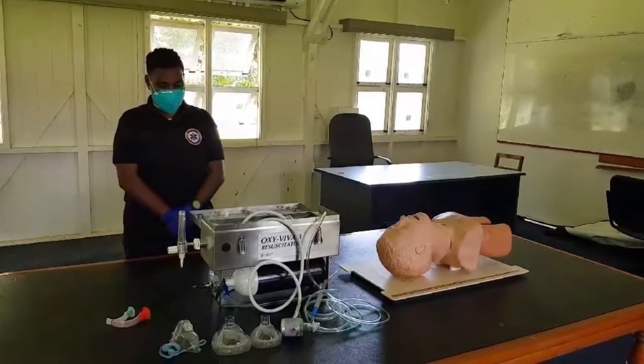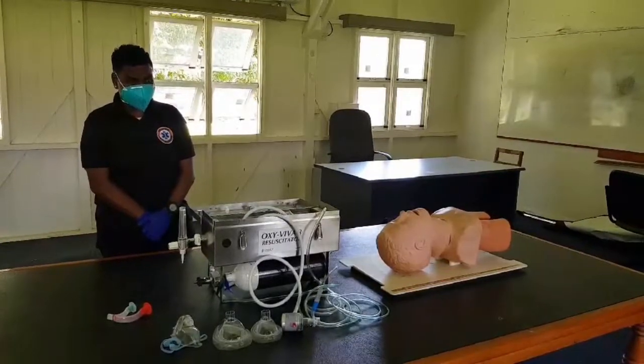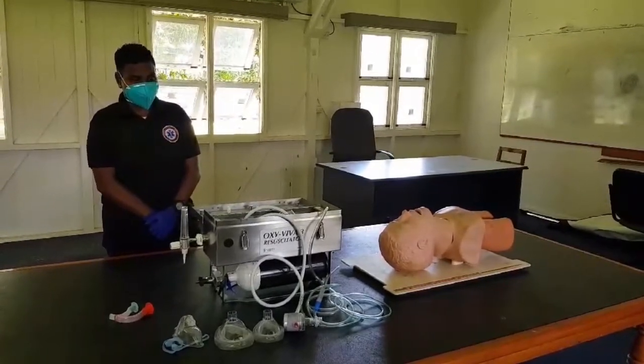One of our volunteers at FACT will be demonstrating how to use the Oxy-Viva 3 for oxygen therapy.